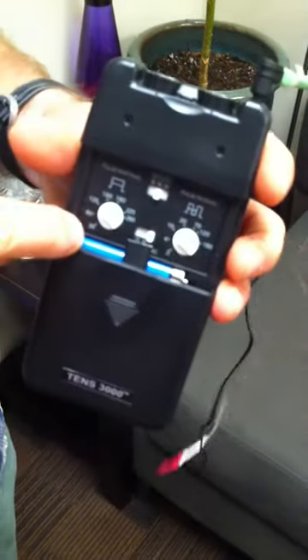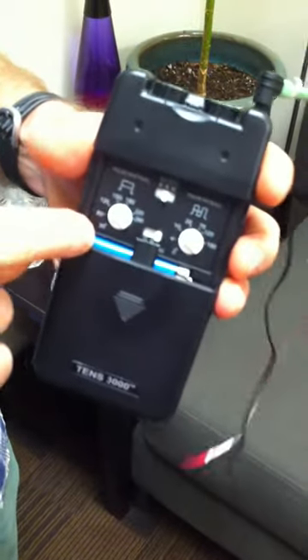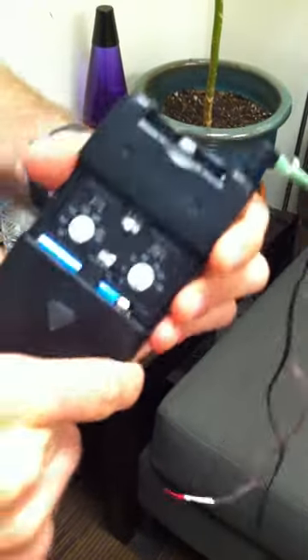We've got an amplitude control. We can control the rate of the pulses as well as the pulse widths. It's powered by a simple 9-volt battery.